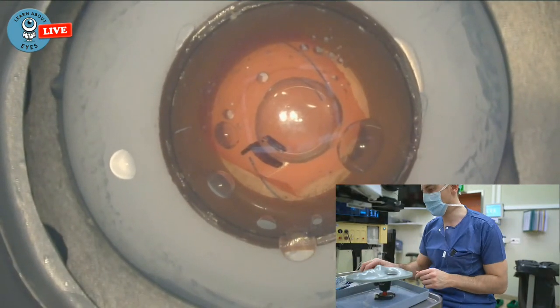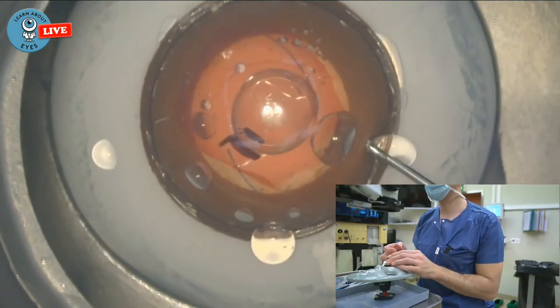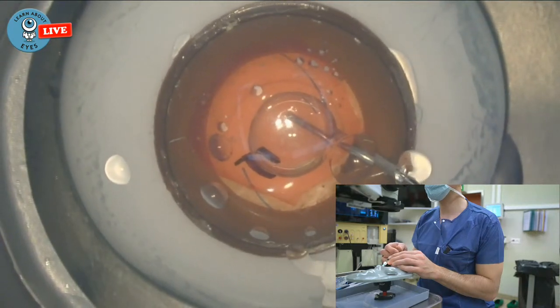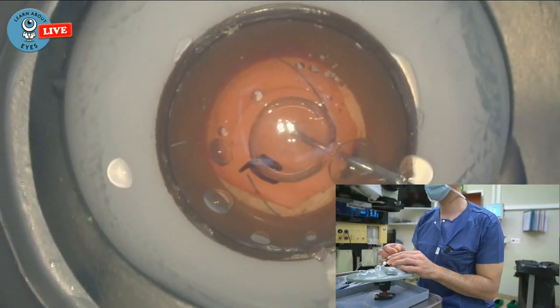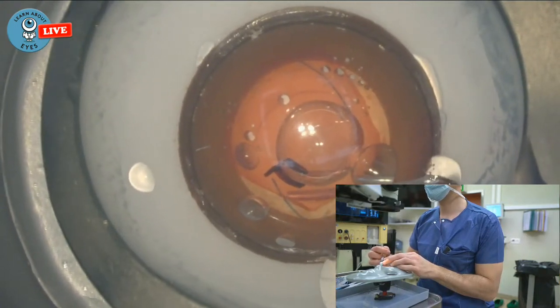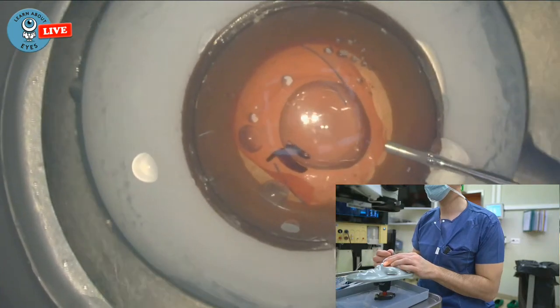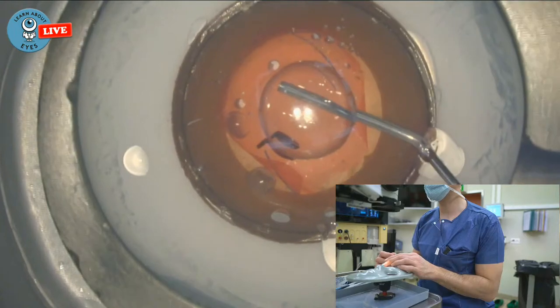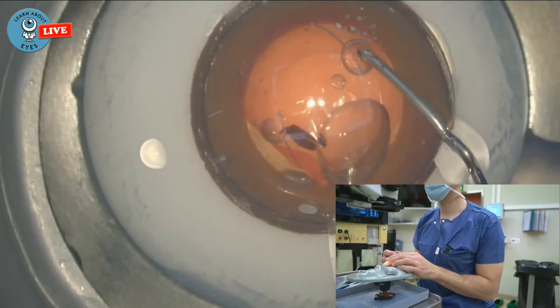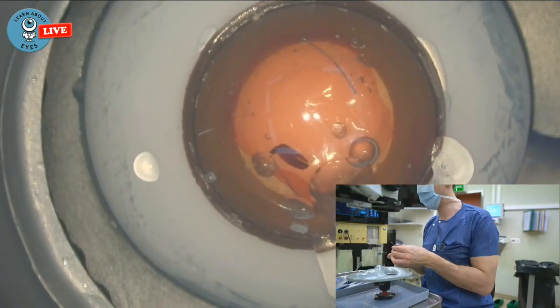I just had a great idea. I'm just going to fill it with viscoelastic from behind. That might help. Keep this sucker from coming back. And now fill it again from the front. Oops, it's empty.